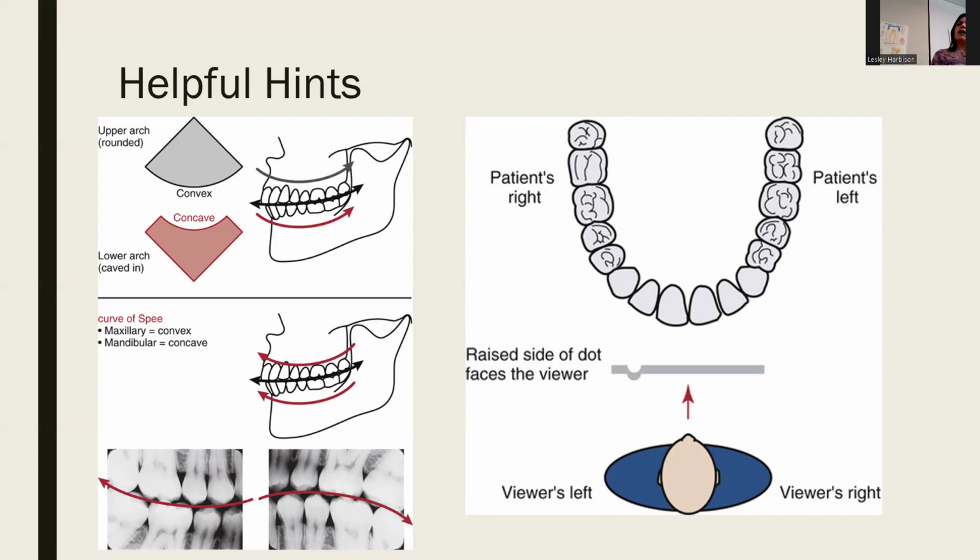Oh, before you develop it, it's on the outside of the package? Oh, okay, yeah, I don't know. I'll have to look. I always learned dot in the slot, so I never really looked for anything on the outside of the package other than where the dot was. Oh, I'll have to look at that. Yeah, I'm not familiar with that. That's cool though.